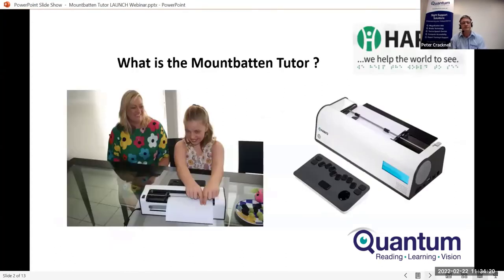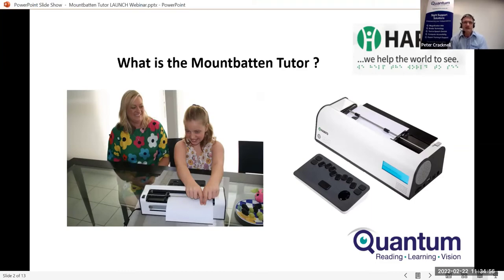The Mountbatten Tutor is the latest version of the Mountbatten Brailler series that Quantum designed and manufactured from 1990, now manufactured by Harpo Adaptive Technology in Poland. Like its predecessors, it's an electronic Braille writer with speech output. Its principal use is in education and early Braille learning, though it can also be used as a Braille embosser. It extends the well-established usages of the Mountbatten LS and Mountbatten Whisperer by adding more connectivity and making it more intuitive for non-specialists to use — including regular classroom teachers, teacher aides and parents.